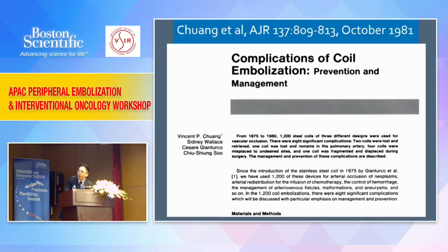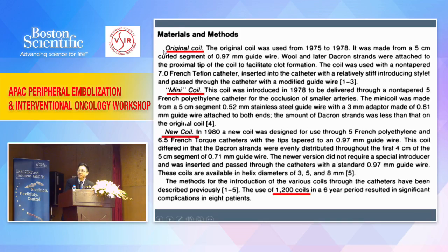Coil in the embolization of vascular abnormality actually dated back to 1975. A rudimentary coil was already developed. Manually cut the guide wire, your 035 or 038 wire. You just cut it, take out the center core, roll it out, and push it in. It does work in many situations. Okay, and they have original coil.